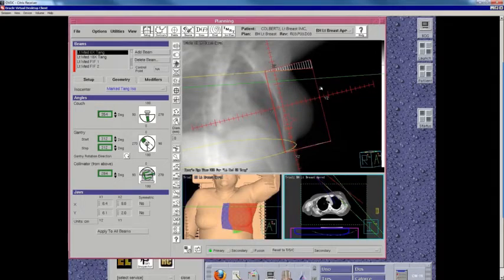The superficial border is easy. You just want to flash the skin. And then inferiorly, I just put my inferior border where I put my wire to denote the inferior border. So typically that's about, as I said, maybe 8 millimeters in my practice from the inframammary sulcus, unless the patient has a very low tumor, in which case I'll put additional margin on the inframammary sulcus.